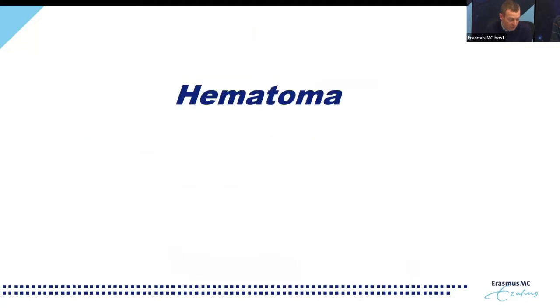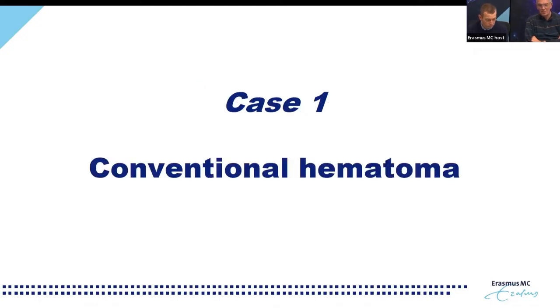in these specific cases. As you know, hematoma is a concept. Hematoma means bleeding in the vessel wall, but the point is that the hematoma might have several distinct causes that might warrant completely different treatment. For that, we created a mixed bag of different cases of hematoma just to demonstrate how that looks in clinical practice and how it can be visualized by intravascular ultrasound.